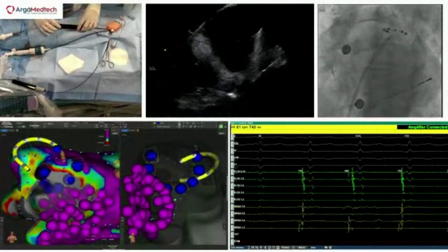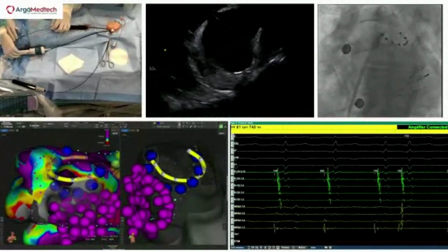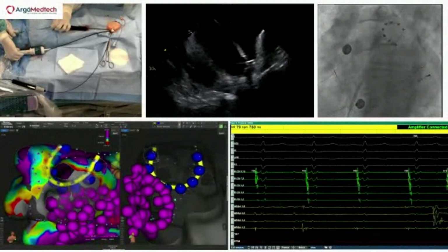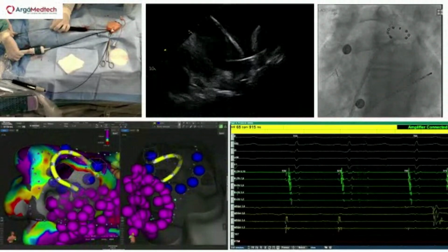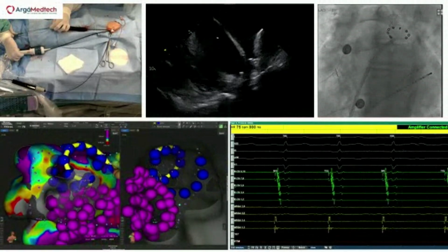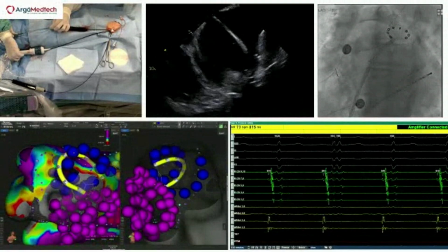So now the patient did some coughing. And of course, as soon as we have coughing, because we are using impedance monitoring, it takes some time to recover. Here, this is posterior, superior, anterior for the left superior pulse 2. Go.